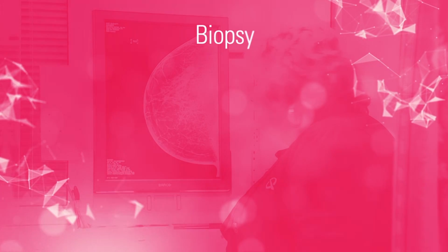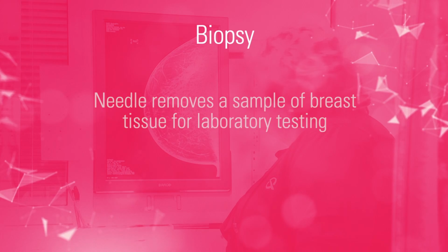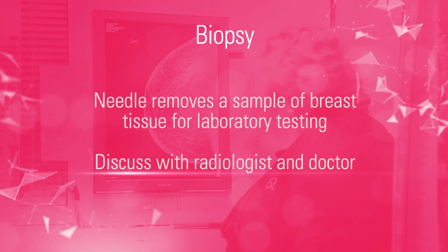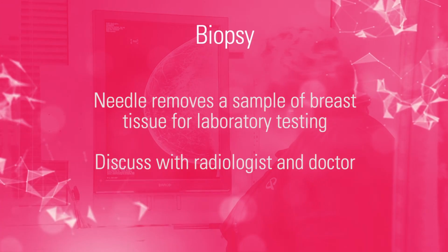There are also times when our radiologist may recommend a biopsy. In a biopsy, a needle is used to remove a sample of your breast tissue for laboratory testing. If this is needed, our radiologist will discuss this with you and your doctor before carrying out any testing.